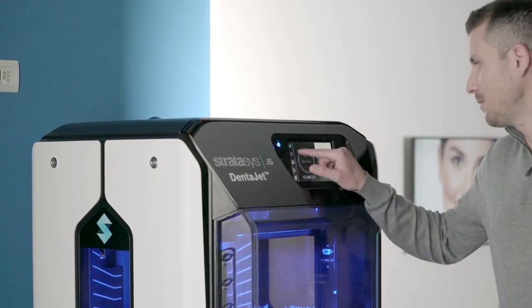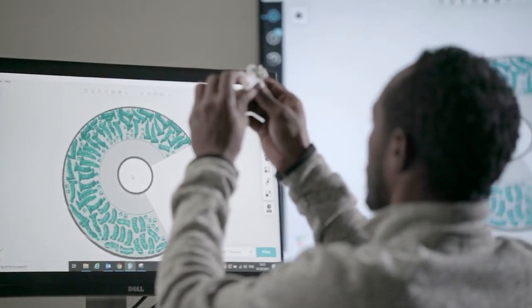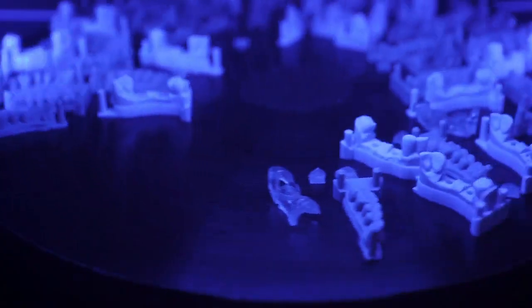Streamline your 3D print workflow with GrabCAD print software. GrabCAD automatically calculates the most efficient arrangement of parts to maximize your single tray capacity, helping to reduce tray changeovers and boost your productivity.